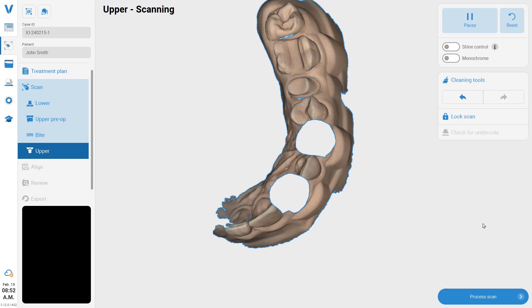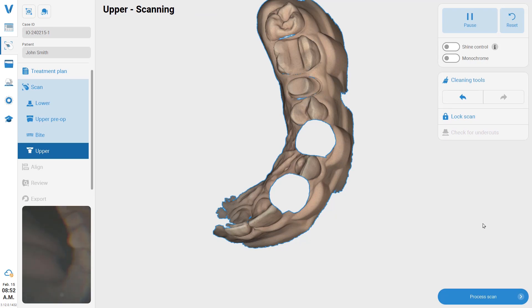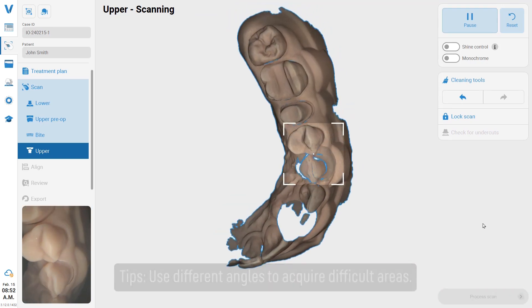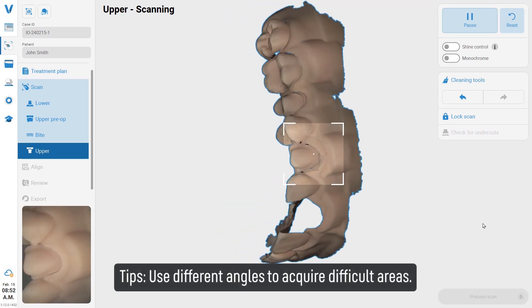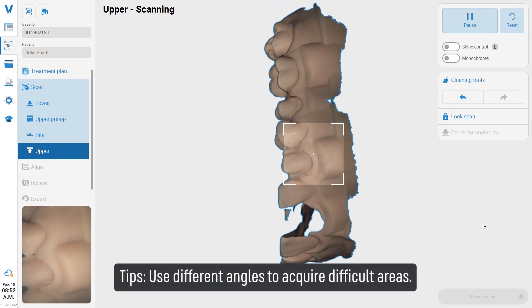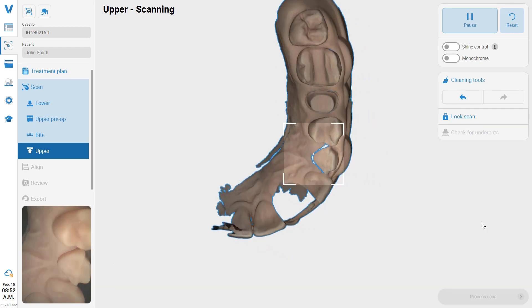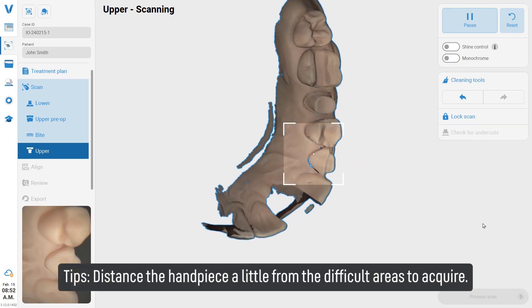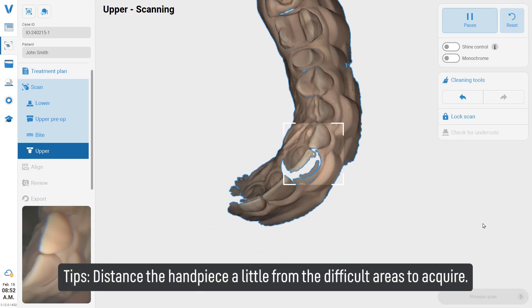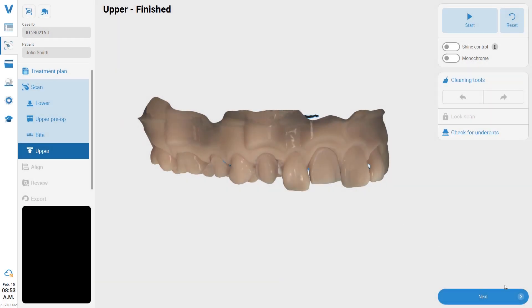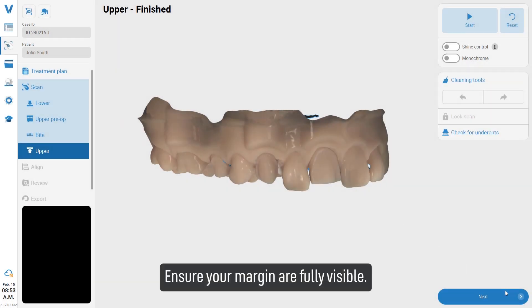Use different angles to acquire difficult areas. Distance the handpiece a little from the difficult areas to acquire them properly. Ensure your margins are fully visible.